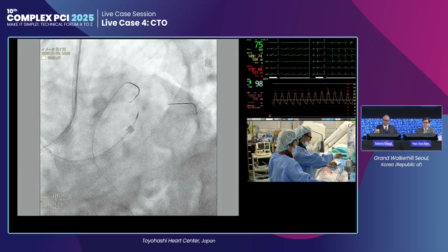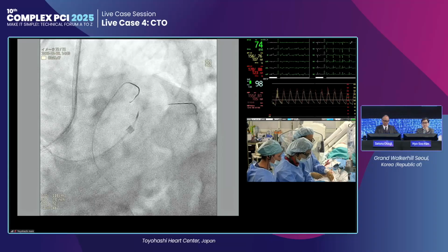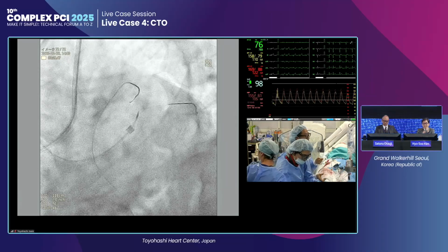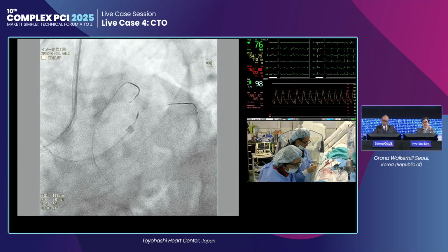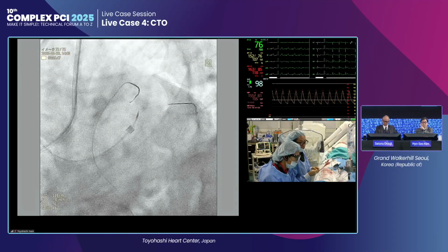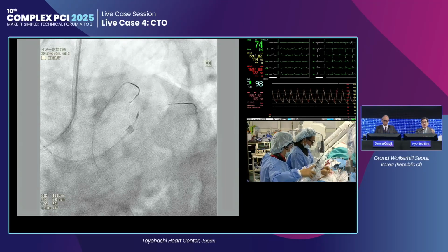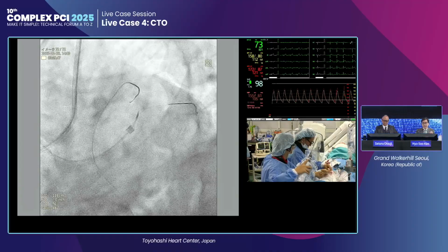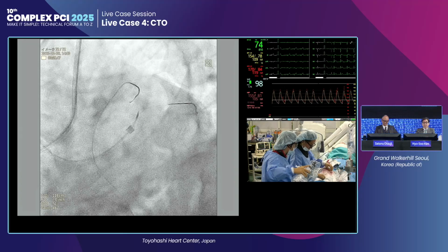So in our previous images, he found the right one just behind the previously tried one. But actually, the starting point is the proximal part, but the direction is downward, to the distal part. So it crosses between many fine branches. That is really difficult, to find the true septal channels from the PDA toward the LAD. But he finally succeeded after 4 trials. It's wonderful.